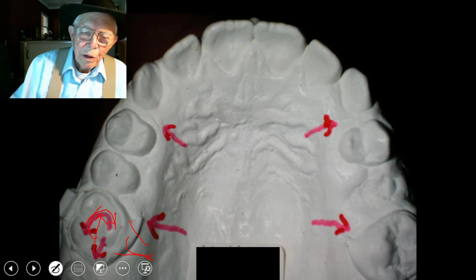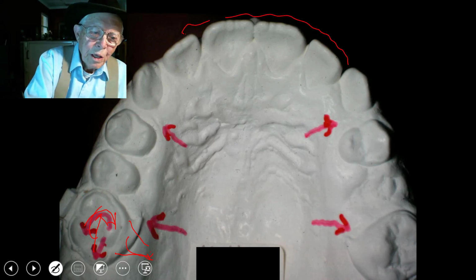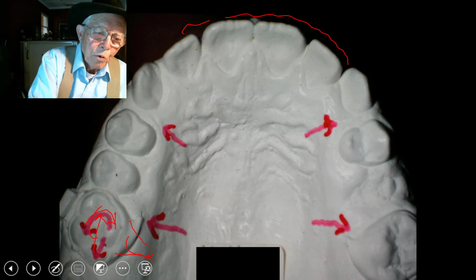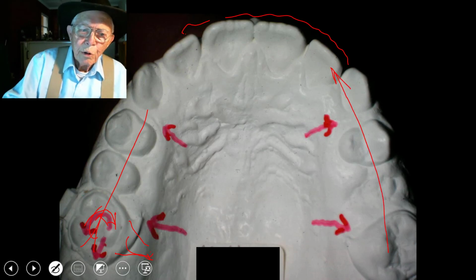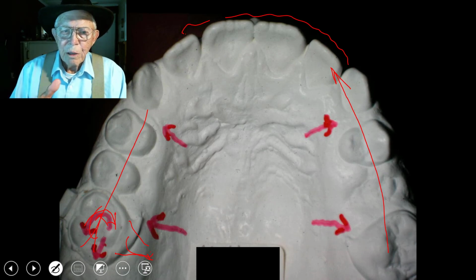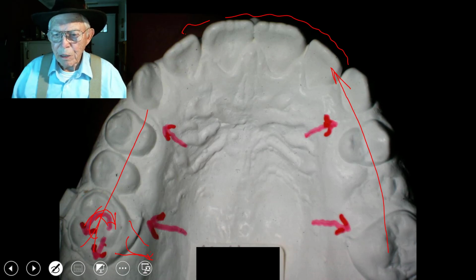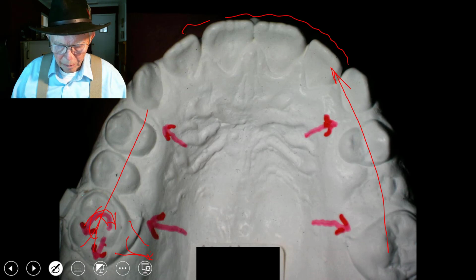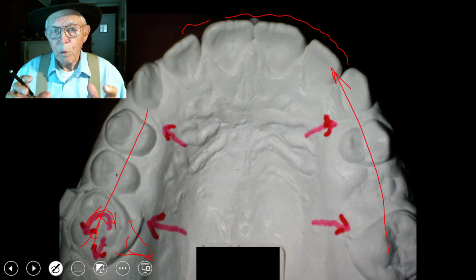Now we'll actually move these teeth forward. We use a lip bumper up here and bring these teeth, every one of them, the molars, everything, forward with that. In other words, we're correcting our class 3 by actually correcting the upper arch and also the lower arch at the same time. And they're correcting either one of them in the same amount. Well, it doesn't have to be the same amount. You can actually correct one more than the other if it works out that way.